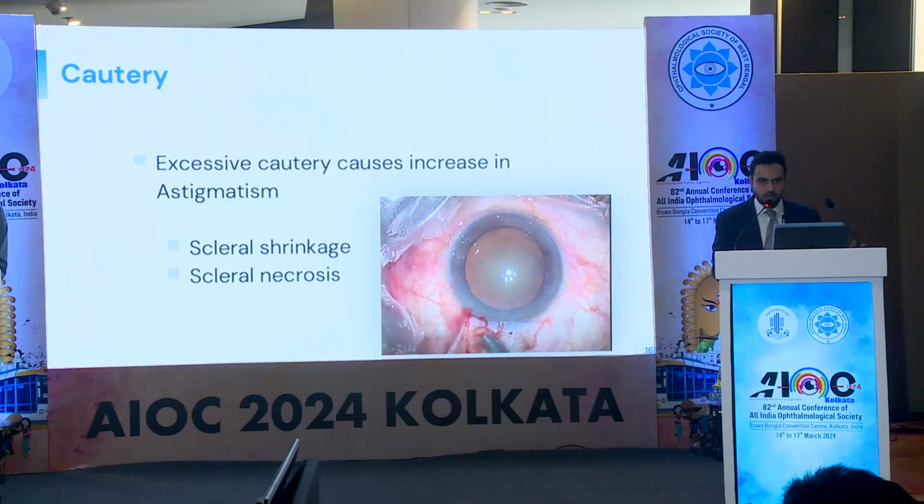So the other thing is cautery. In SICS, we do use cautery. At our center, we usually do not use cautery. But if we are using cautery, we should be very careful because it may cause scleral shrinkage and scleral necrosis, which may result in more astigmatism.